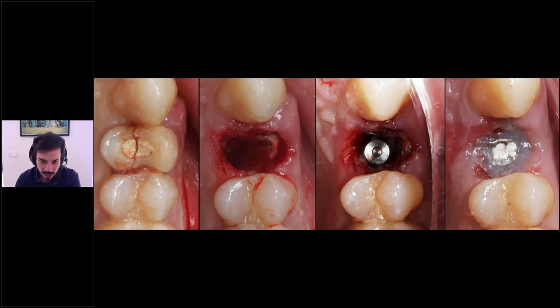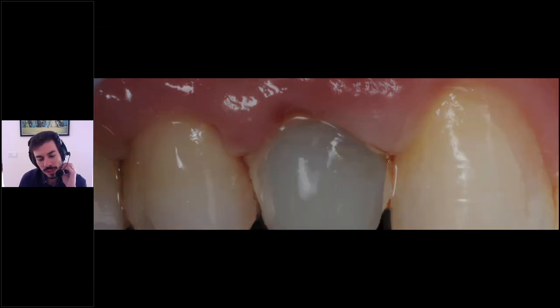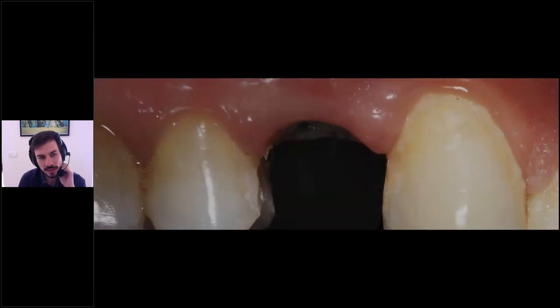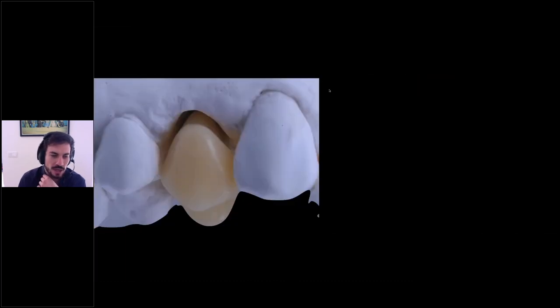If we don't have the chance to have enough stability of our implant, we should go for something like this, a customized healing abutment. And nowadays it's super easy to do it with the VPI innovative tools, and then go for a Maryland bridge bonded like this. And at 4 months with one surgery, we are able to have this kind of gingival architecture. Everything is in place, the papillas are in place, the buccal volume, the color of the tissue, and then we just need to make an impression.